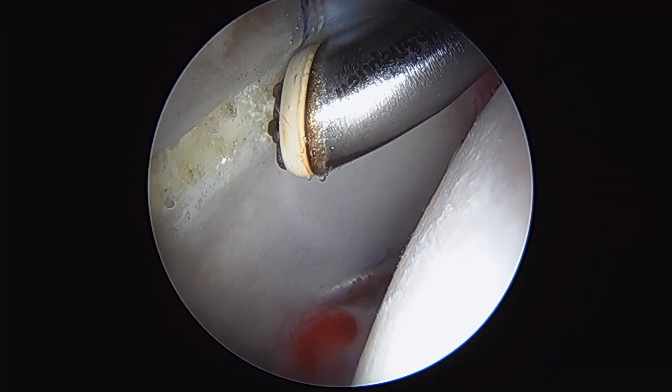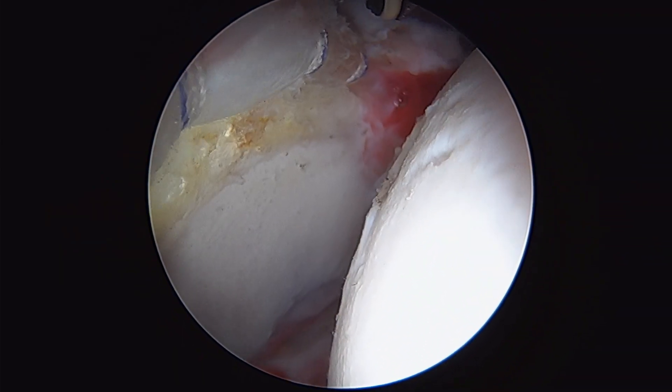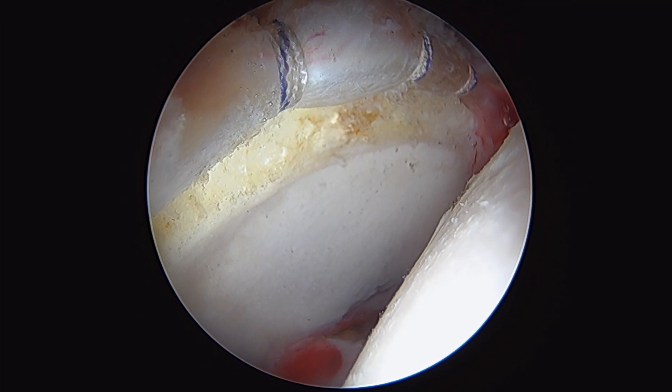We've also performed a little bit of chondroplasty here along the rim, just taking down that edge of cartilage. And it looks really good — a really good labral repair there.